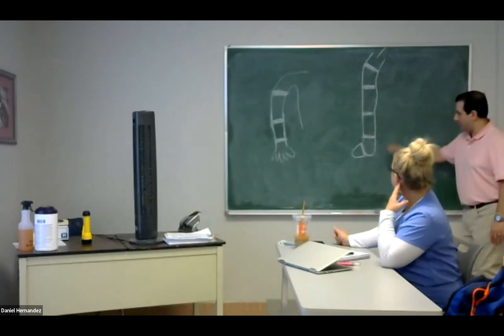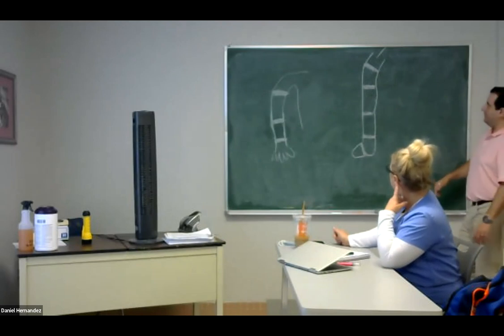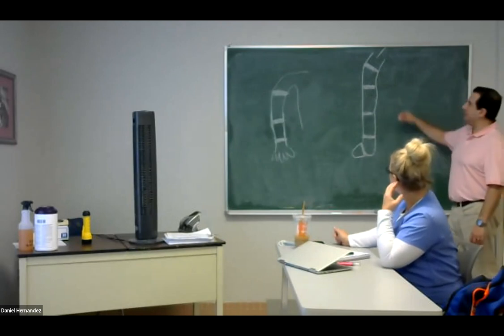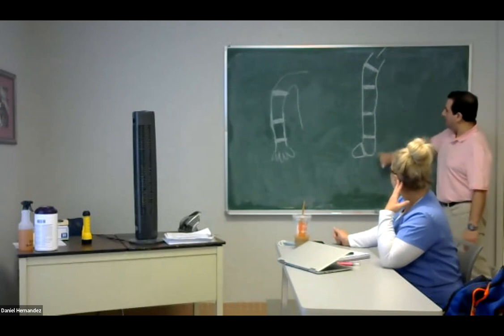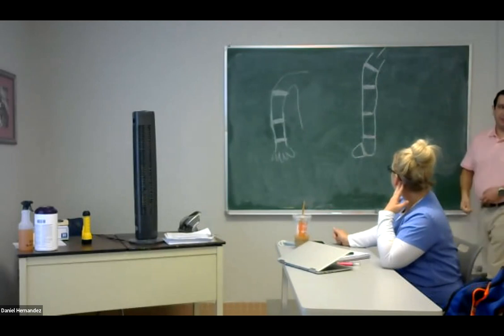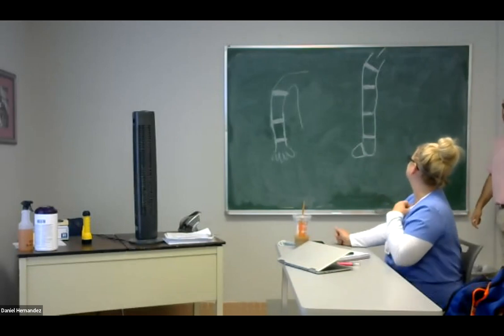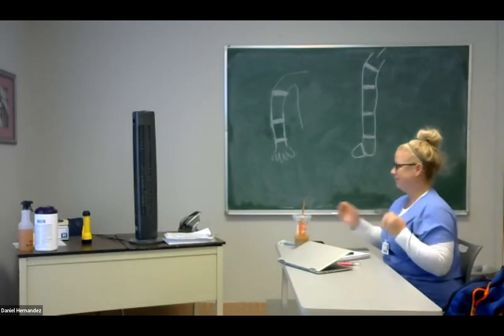If one leg is abnormal and the other leg is normal, then it's got to be iliac. If one leg is all abnormal and one leg is all normal, it can't be aorta, because it would be both. So it'd be your right iliac, in a sense.